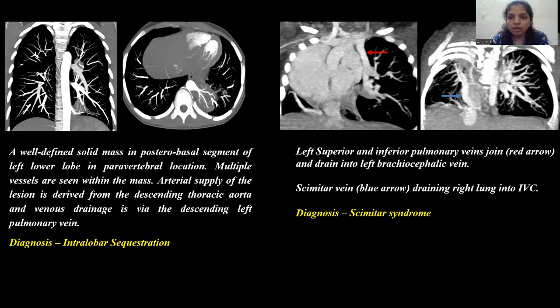Coronal contrast-enhanced CT images show the left superior and inferior pulmonary veins joining and draining into the left brachiocephalic vein. The right pulmonary vein is seen draining into the IVC. This is a characteristic finding of Scimitar syndrome.